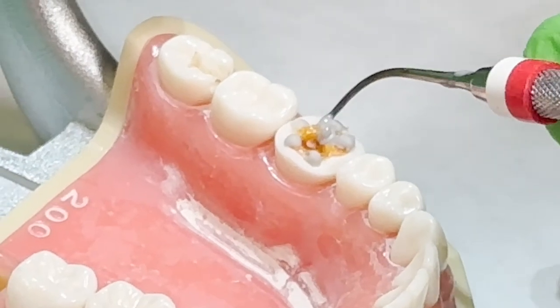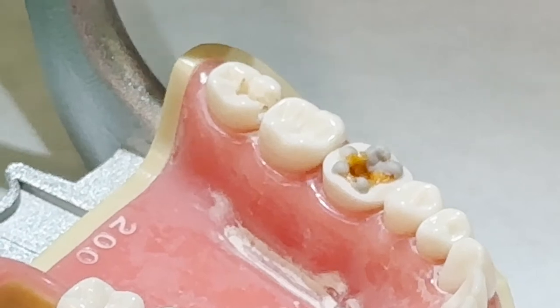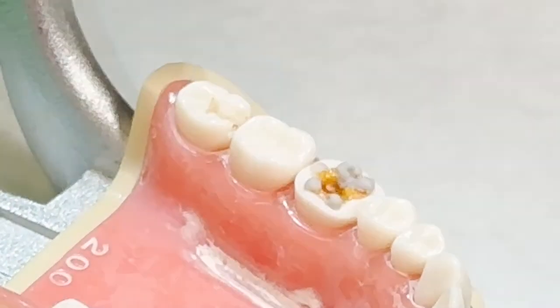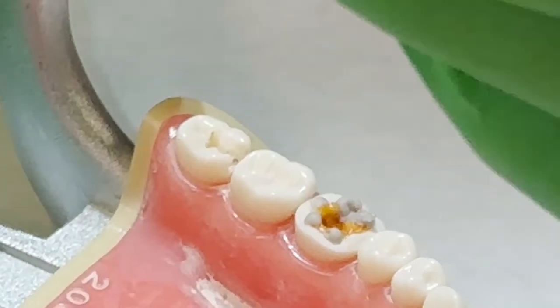Are you wanting these cusp tips to touch the sticky wax? Yes. Now it doesn't matter. Everything can touch the sticky wax. It'll all be blended together and it should stay on your Typodont, okay?